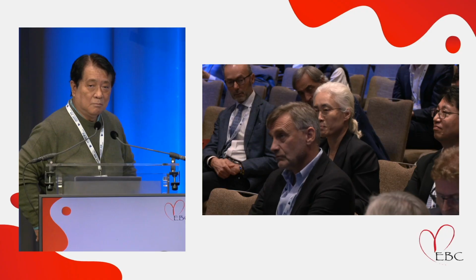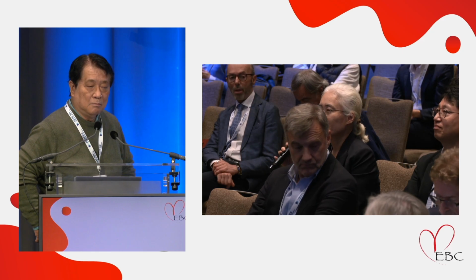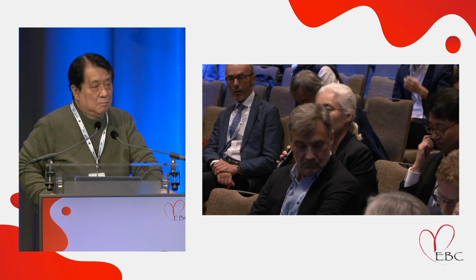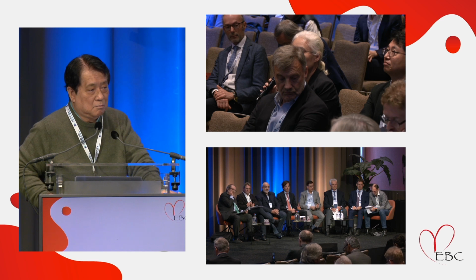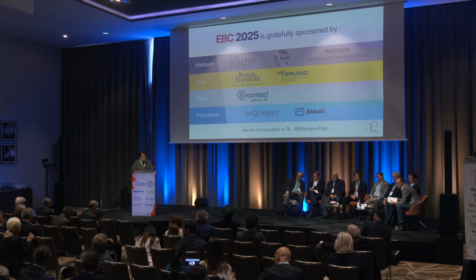I want to do my best to make a good lesion preparation. And on the circumflex ostium, it is very difficult to make the optimal lesion preparation. So I usually choose the optimal size by angiography, with the scoring balloon first, and then I slightly upsize with a non-compliant balloon with high pressure application for the ostial lesion.